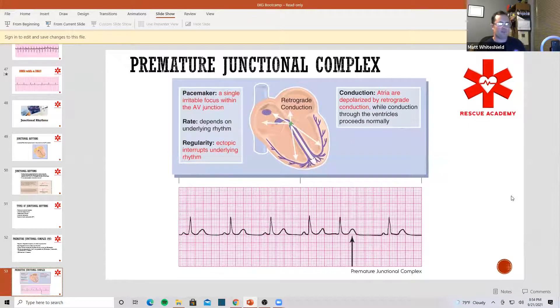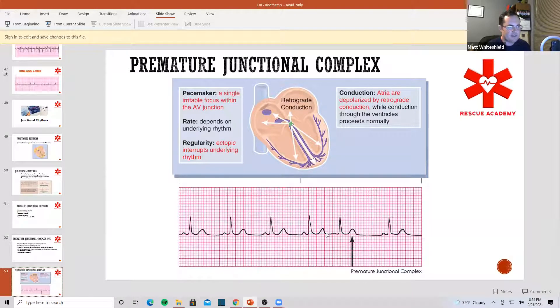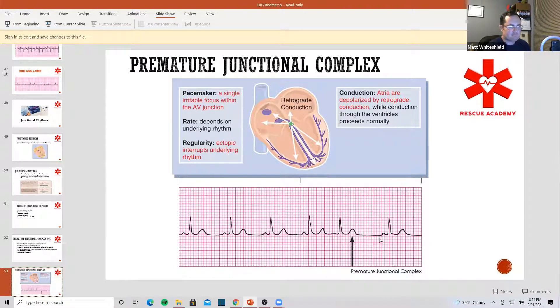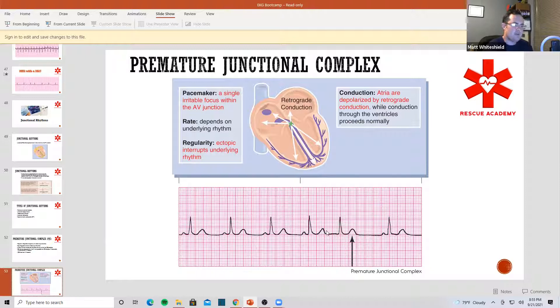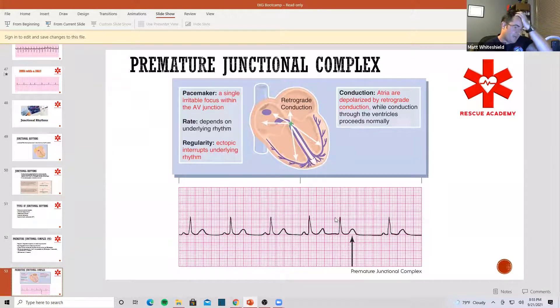Let's take a look at one. We see sinus rhythm here — P-wave, QRS complex, T-wave. All of a sudden we have a premature beat that occurs and kind of throws off what's going on. There's a little bit longer of a delay, and it starts back up again. There is no P-wave in front of this beat — just a little T-wave here. That's a premature junctional, and the only way I know it's junctional is that there's no P-wave in front.